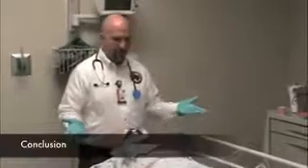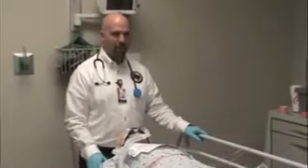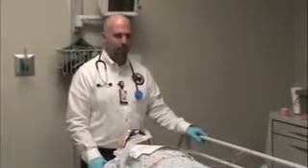So this is some of the basics of mechanical ventilation with your EagleMed ventilator. If you have any questions, feel free to email the Clinical Services Department, and we'll be happy to offer you additional training.